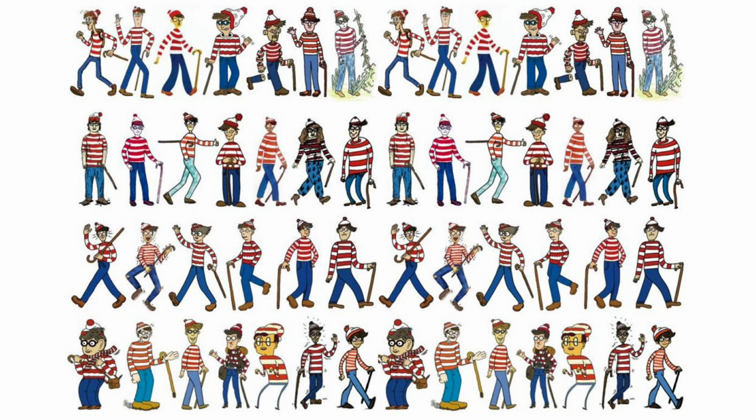And we're starting to learn that in radiology, it's sort of like this, where if I asked everybody in the audience to draw a Waldo, they're all different, and sometimes our machine is good at picking them up and sometimes not, but this is a wide distribution, and this distribution changes over time or setting.